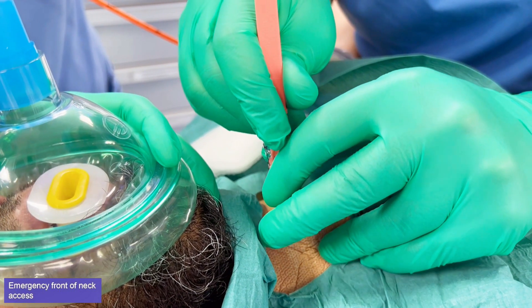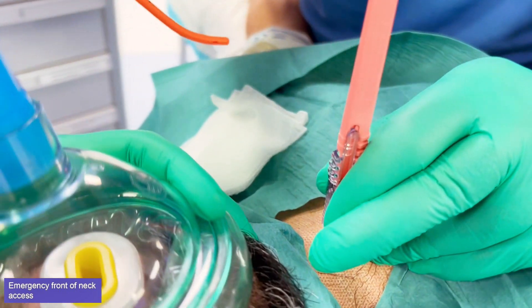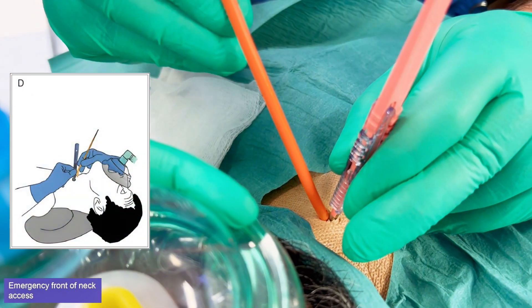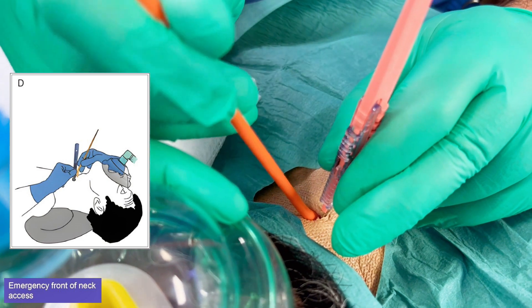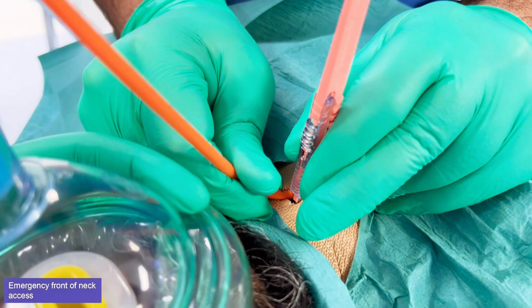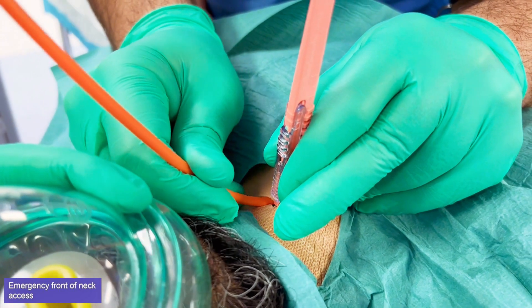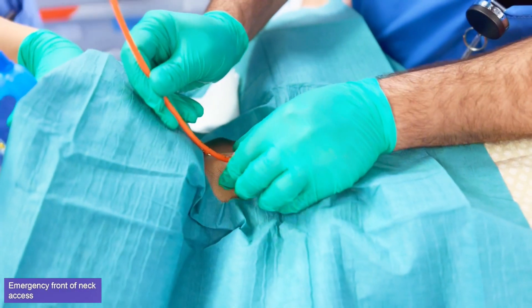Swap hands so that you are holding the scalpel with your left hand. Take the bougie in your right hand, parallel to the scalpel and at a right angle to the trachea. Push the tip down along the scalpel blade, keeping contact with the blade until the bougie is in the trachea, then remove the scalpel.